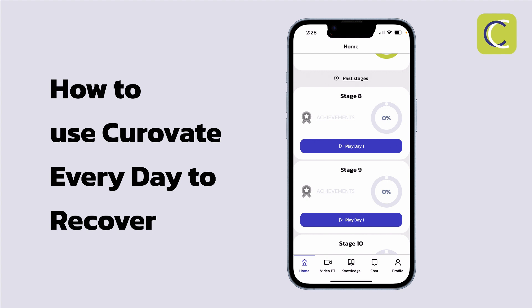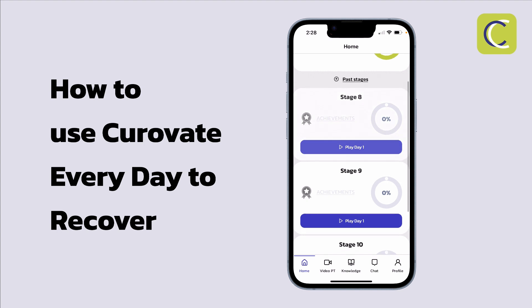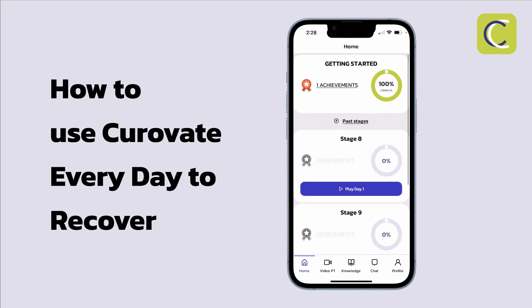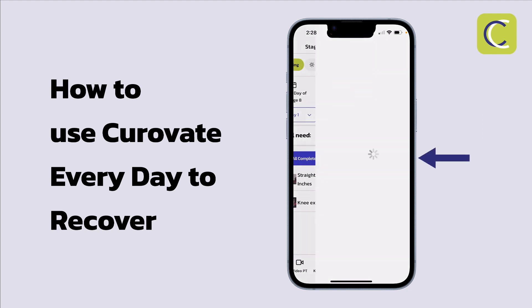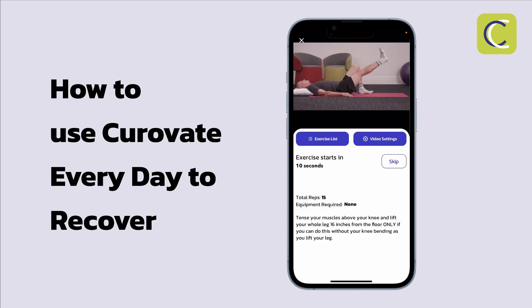As I said, if there are any questions as you're recovering and working through what you need to do day to day, simply use the in-app chat. When you arrive in the Curovate app, all you need to do to recover is press play day one, then press play all, and complete your exercises in order to optimize your recovery.